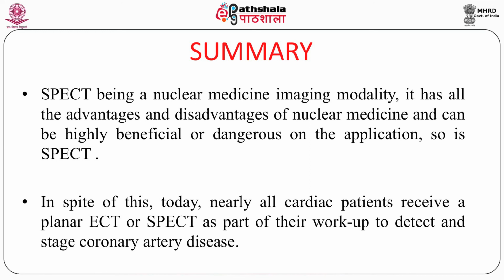No doubt the gold standard as far as the heart is concerned is angiography. The cardiologists feel that angiography is the gold standard to find out the functioning of the heart. But in nuclear medicine, non-invasively, without putting in a catheter and all those things, you can just give thallium or technetium-99m, maybe MIBI, and find out how the heart is functioning, and then you can treat it. So nuclear medicine and SPECT play a very important role as far as functional and anatomical images are concerned. In today's world, nuclear medicine is one of the very important modalities, and without an invasive procedure, non-invasively, you can detect the disease at an early stage and treat it.